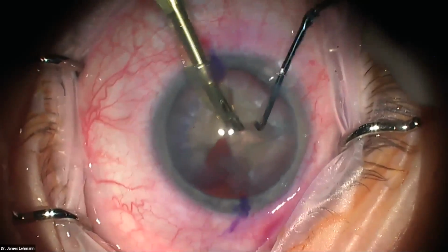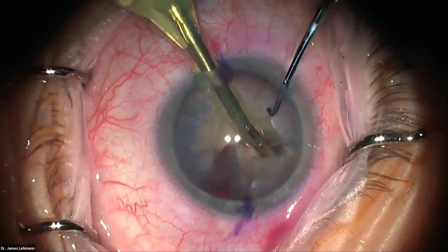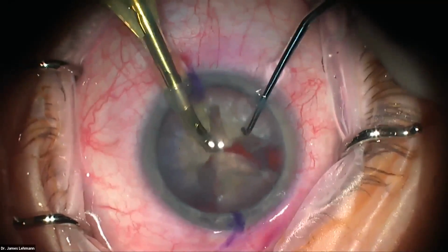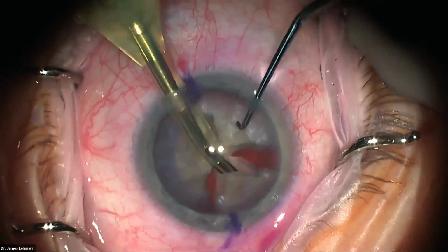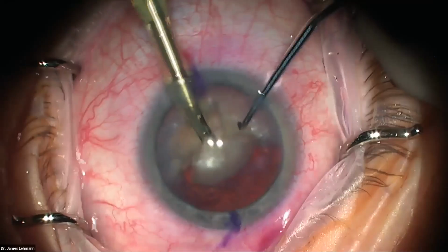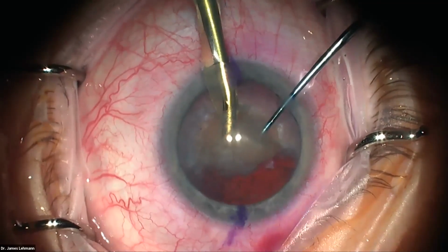And then, I'm not going to go grabbing stuff. The best thing to do, especially if you're a beginner phaco surgeon, is to always move the piece directly across from you, okay? That way you're always doing the same move, and you know how that little piece is going to come to the phaco tip. You're not guessing that it's going to flip or anything.